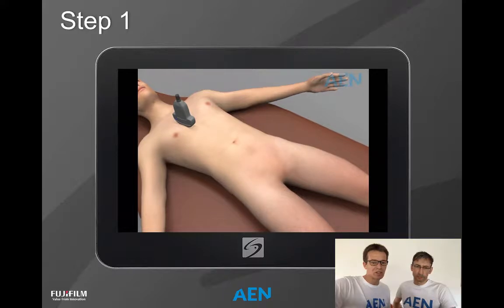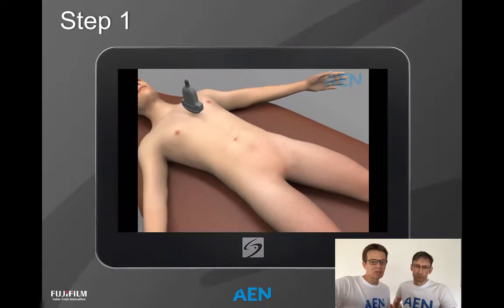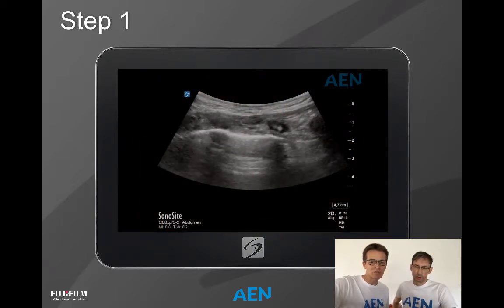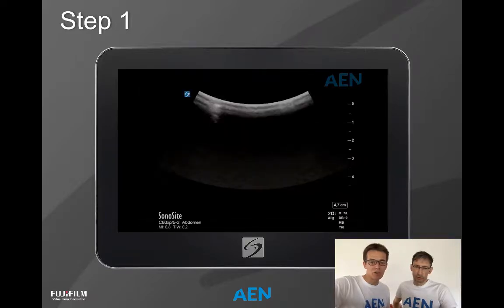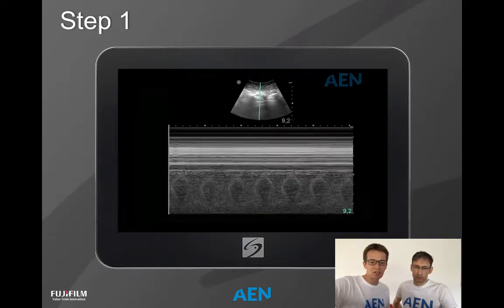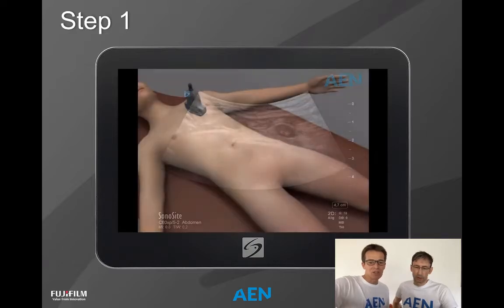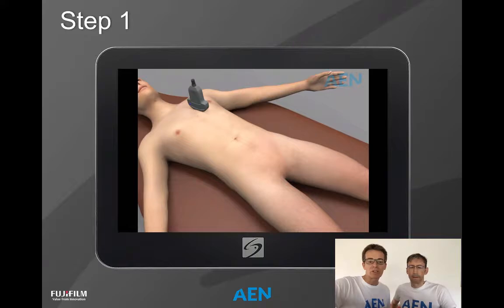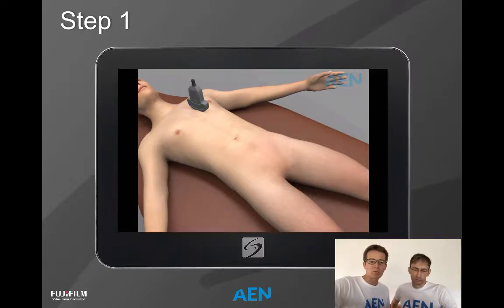The second and third positions are the pleural positions. On the right side we look at the ultrasound and use M-mode — the motion mode — for a typical seashore sign. Then we change to the other side where a little of the heart is also visible in M-mode. It is important to look at these three positions first, because a pericardial tamponade must be treated very rapidly as it can kill the patient quickly. If not present, you move on to pneumothorax, and in the case of tension pneumothorax, you must solve this before proceeding with your examination.